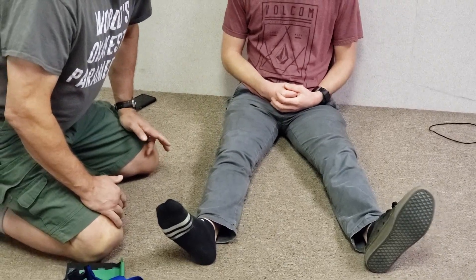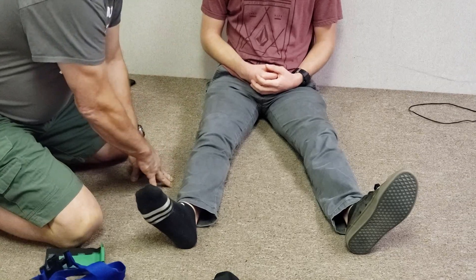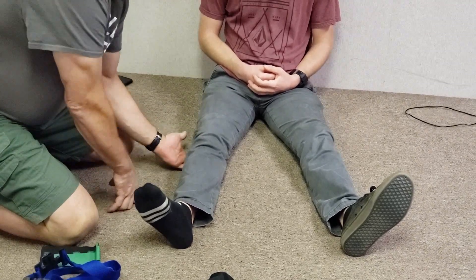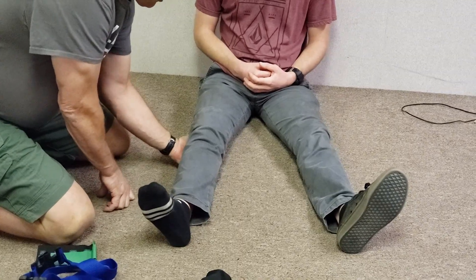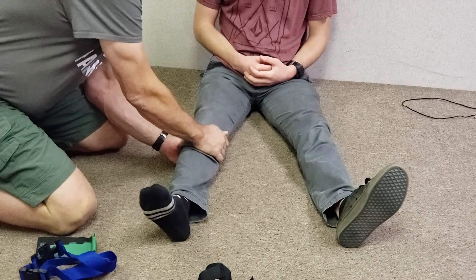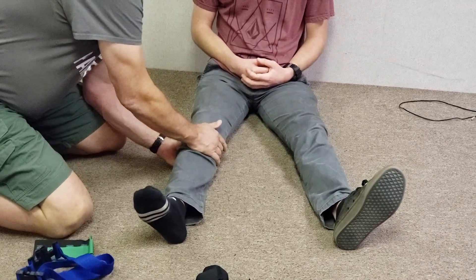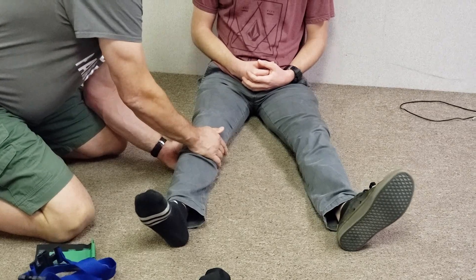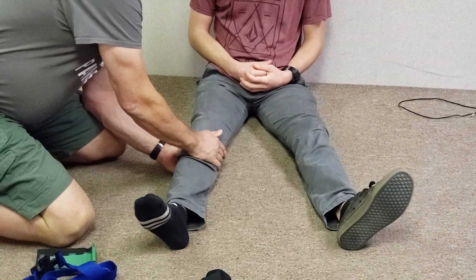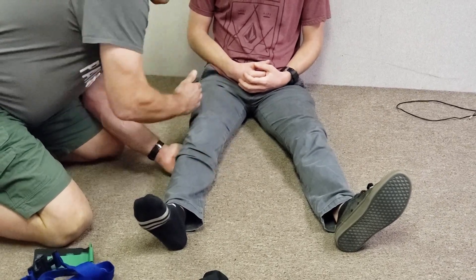Since we don't have x-ray vision, one of the easiest ways to determine suitability is by applying gentle traction, as I'll demonstrate here. Warn the patient that they're going to feel a little pull — about 3 to 5 pounds of pressure. Normally the patient will be surprised or startled, they're scared, it hurts, and then it immediately gets better. If the pain diminishes dramatically with traction, then you know you're good.